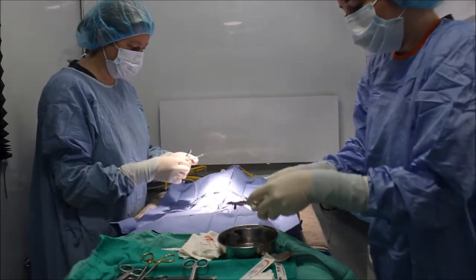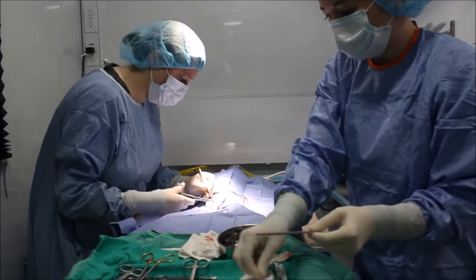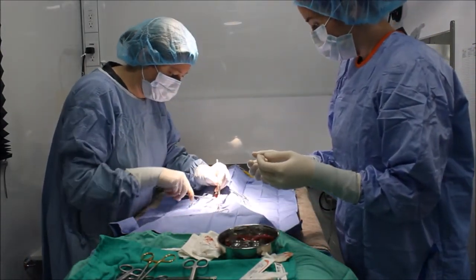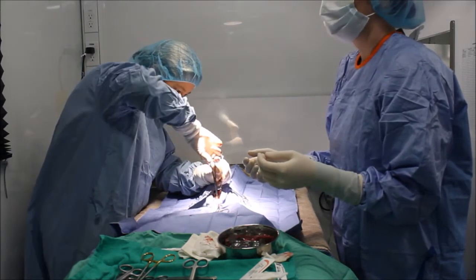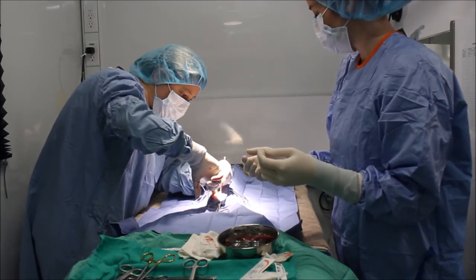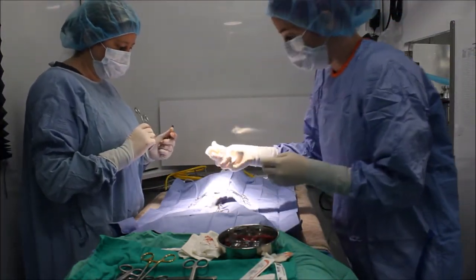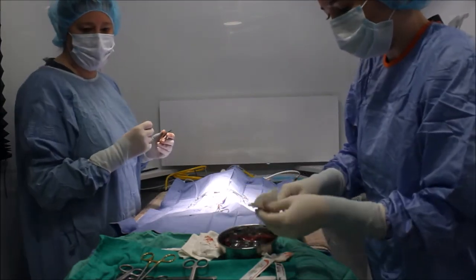We've removed those and we're going to put them over here. I'm going to blot a little bit to maintain hemostasis and a clear visual field.